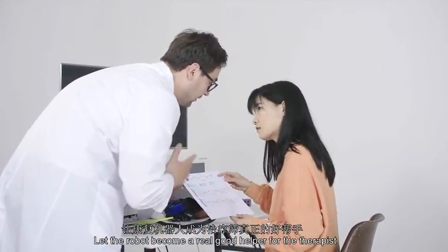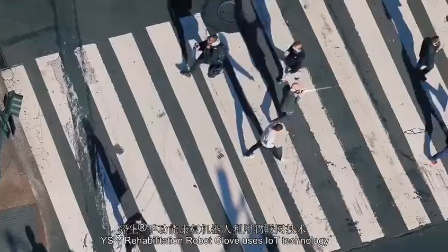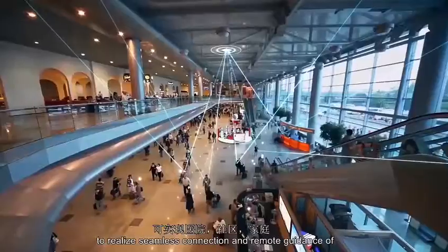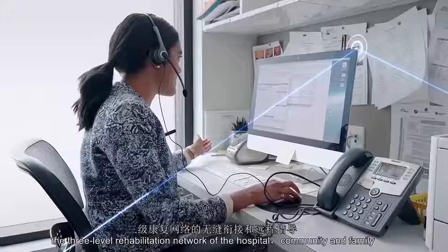YS Rehabilitation Robot Glove uses IoT technology to realize seamless connection and remote guidance across the three-level rehabilitation network of the hospital, community and family.